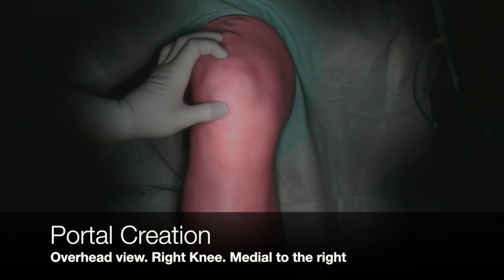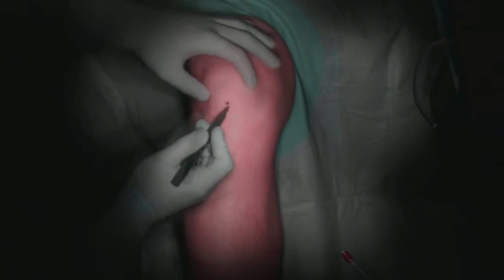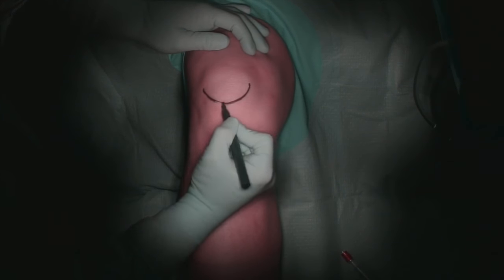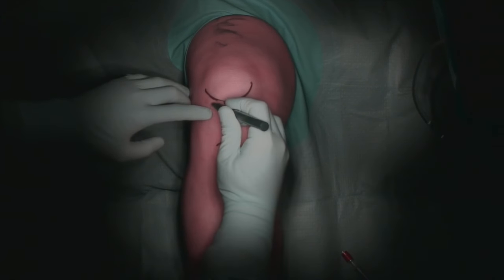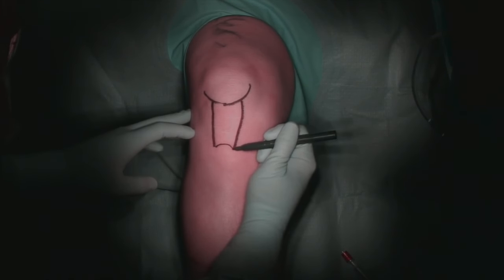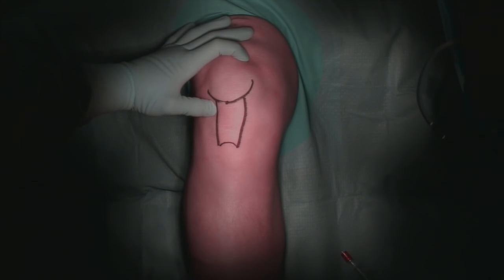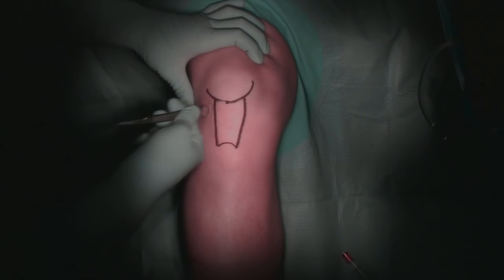This is an overhead view of a right knee, with medial to the right of the screen and the patient's head at the top. Bony and soft tissue landmarks are marked on the skin. The inferior half of the patella and the tibial tubercle are first identified and outlined. Next, the edges of the patellar tendon are carefully palpated and marked. The soft spot immediately lateral to the patellar tendon at the inferior aspect of the patella is palpated, and its position can be confirmed with the handle of the knife. This is the site of the anterolateral portal.